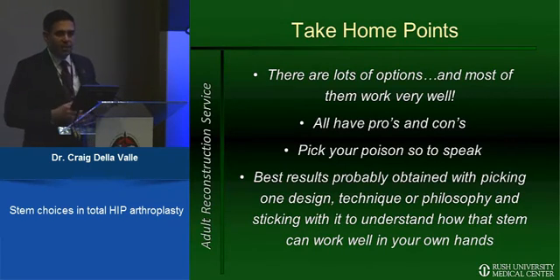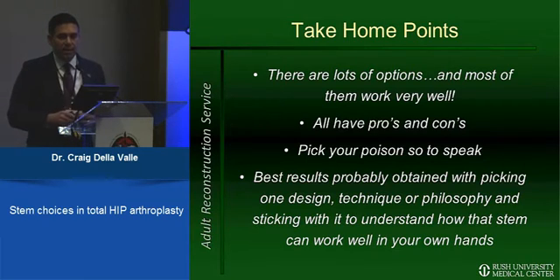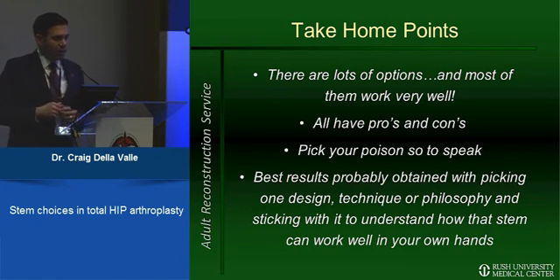So I think the take-home point is we're lucky. There are lots of options out there that work very well. All have pros and cons. I think you need to pick your poison and really understand and stick with one surgical technique. I know there's some literature out there that shows that in particular low volume surgeons tend to switch around a lot and use lots of different kinds of implants, and in general I think that's going to be your worst results and your highest risk of complication. So pick one stem, pick one philosophy, get really good at it and use that all the time. Thank you.